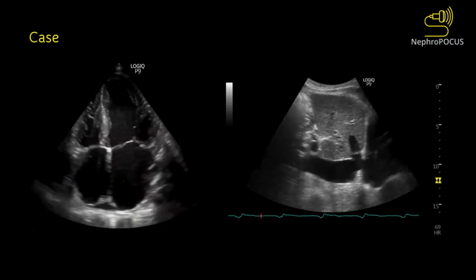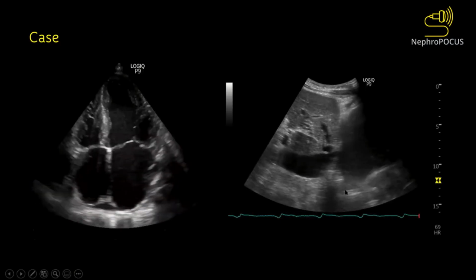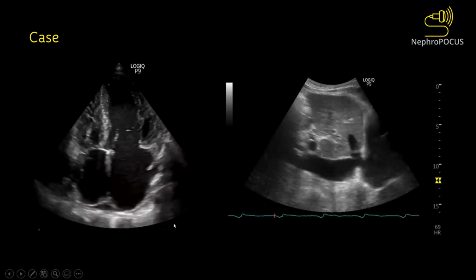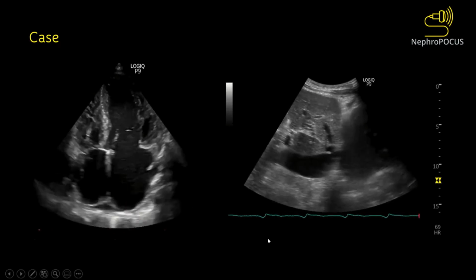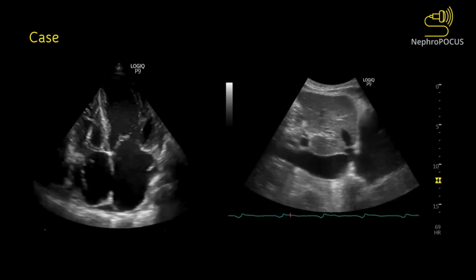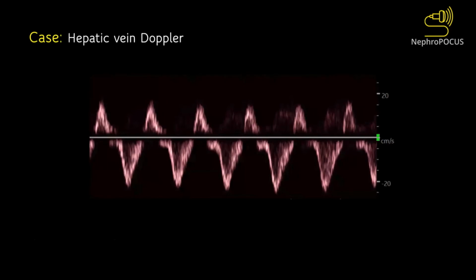But the nephrology team comes and performs a point-of-care ultrasound, which shows, obviously, we know it's a low ejection fraction, the LV is not beating well. There is biatrial enlargement, so chronically elevated filling pressures probably. And the IVC is plethoric and non-collapsing. Okay, this is suggestive of more congestion. So let's look at the hepatic vein Doppler. The hepatic vein Doppler shows this up and down, up and down. I mean, one thing I can say is, is this possible?